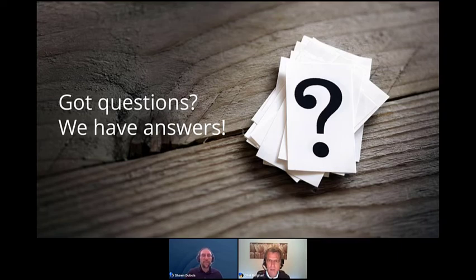Okay. And I know this is a common question. What happens if my sample fluoresces, but it doesn't change color? Yeah, that's a tricky one, and I would definitely suggest reaching out to our technical service for some specifics about your sample and why that would be happening. But in general, there can be other organisms that naturally create fluorescence that might be present, that could be causing that reaction to occur.